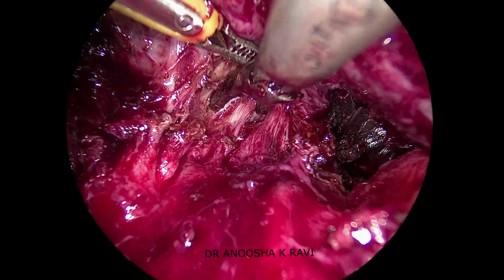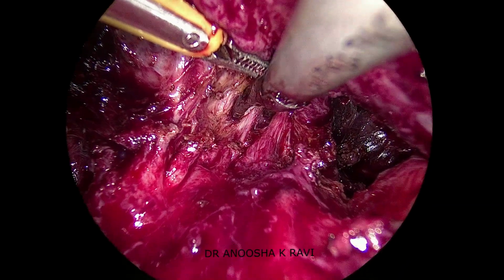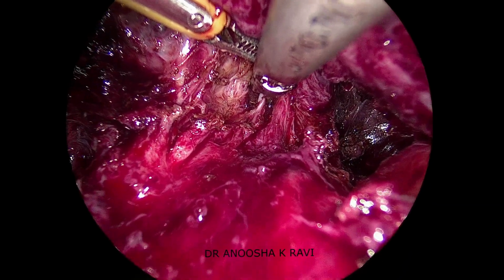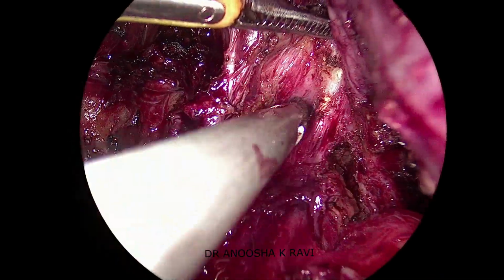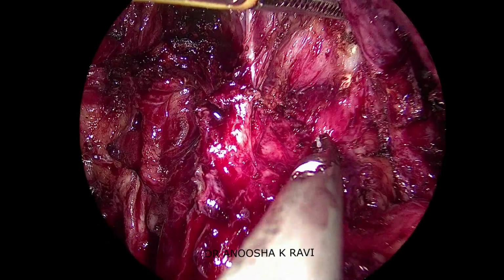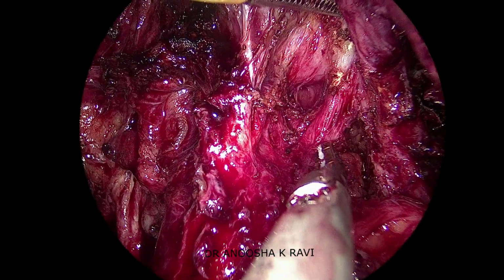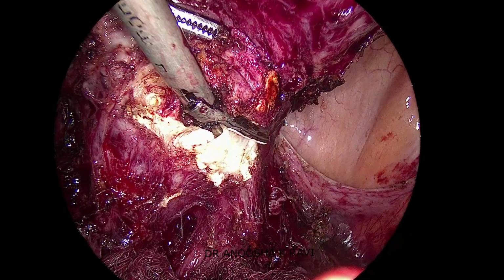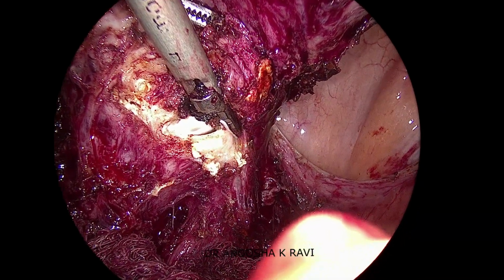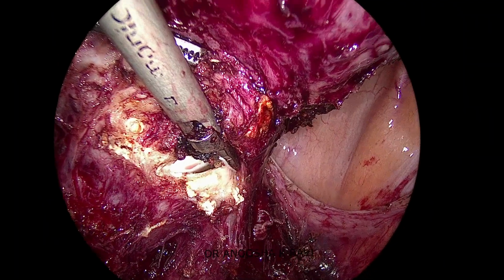Now we can appreciate opening of rectovaginal fascia. Again, rectal probing is done to confirm the right dissection. After this, the usual steps of laparoscopic hysterectomy are done, followed by opening up of the vaginal vault.